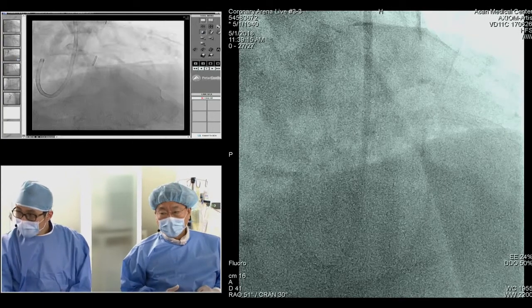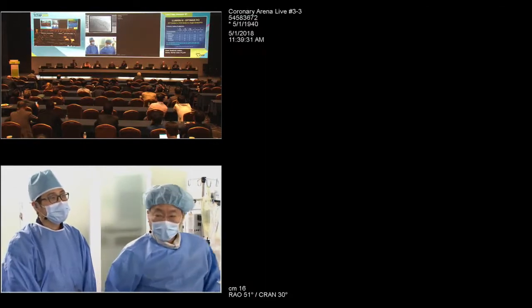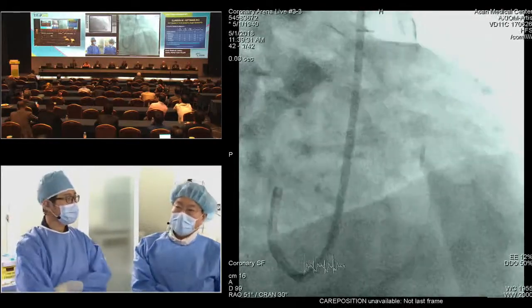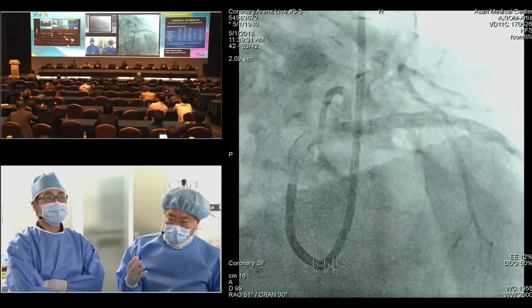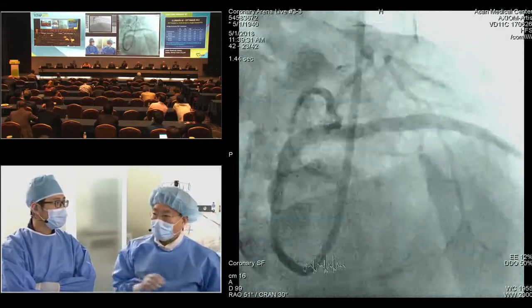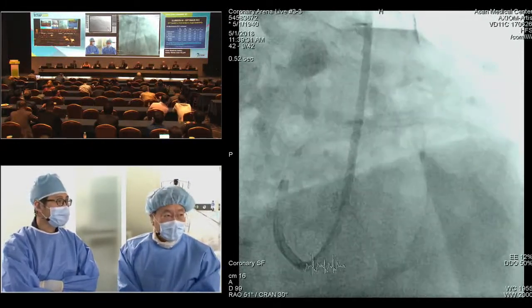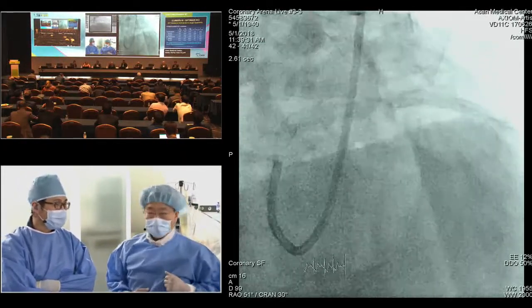SGK, this patient has silent ischemia at 78 years. So what are the indications for complete revascularization for such a man? Complete revascularization, all right, I understand. However, if it is a big territory vessel, it must be treated. However, where there is stenosis in relatively small branches, I think optimal medical treatment is quite enough. So, to be honest, this case is a very tough one.